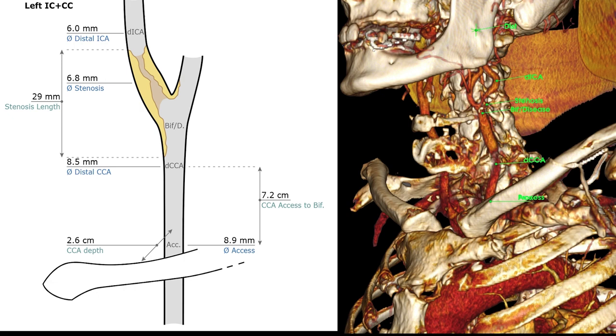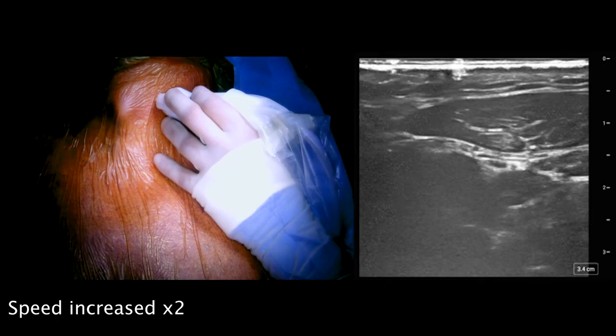In our case, the disease started before the carotid bifurcation, so we had to measure its distance to the clavicle. Based on case planning, the patient and the lesion were suitable to perform TCAR.